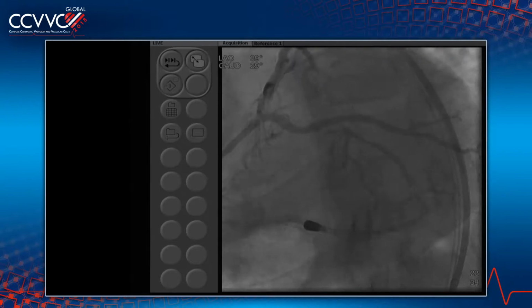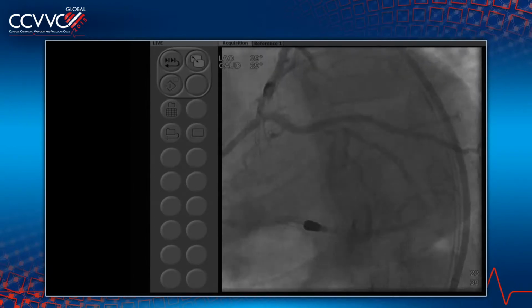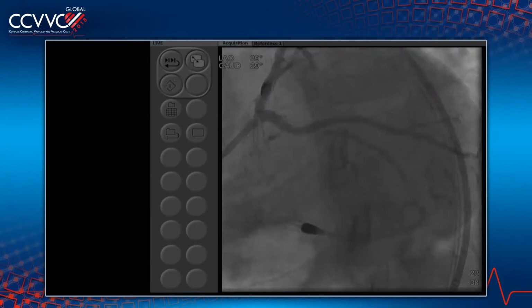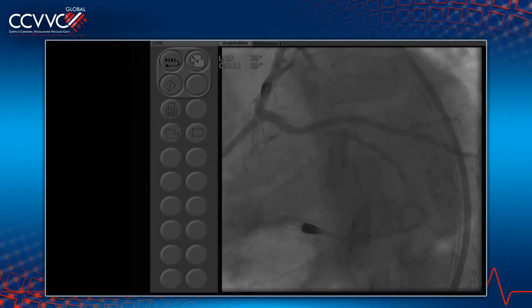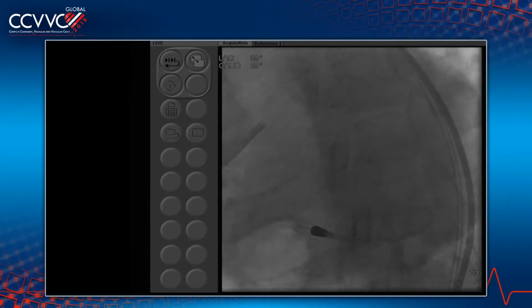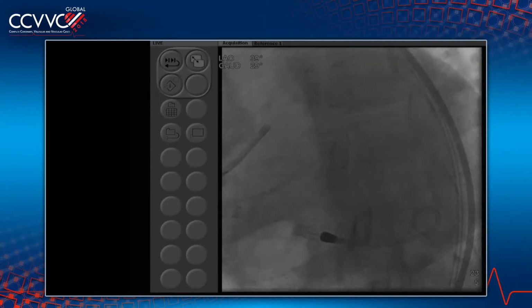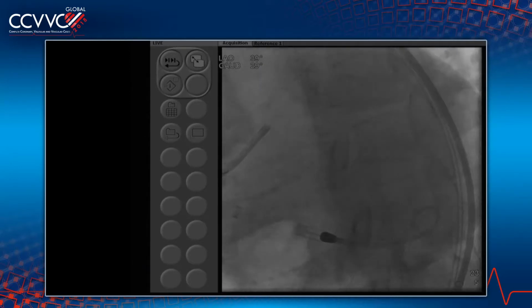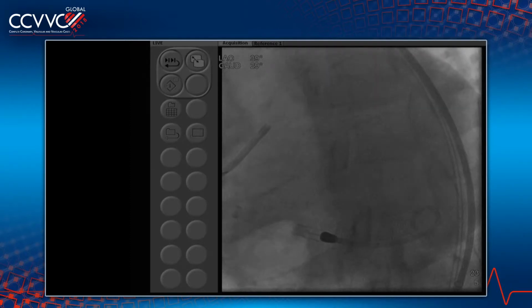Raj Makkar, did you have a comment? I see you leaning. I agree in terms of using Impella. I think it's prudent. It gives you all the time that you need to take care of everything very meticulously. In this case, I also agree with Antonio that we need to fix all the other branches. There are 2 branches there, and in somebody whose EF is really low, and you have the Impella, I think it's the appropriate thing to actually go after those branches and fix them too. I'm curious about the left main. I'd like to know more about this.